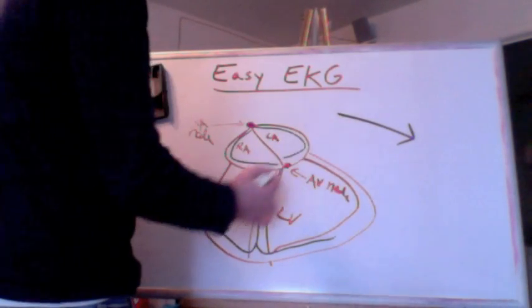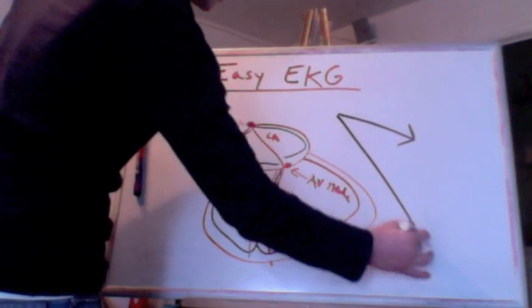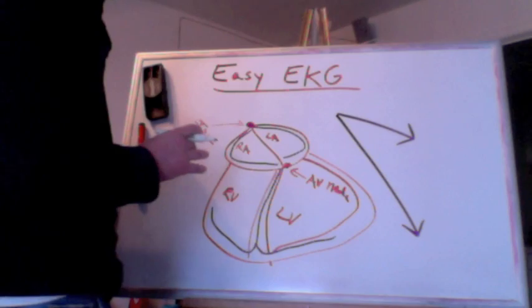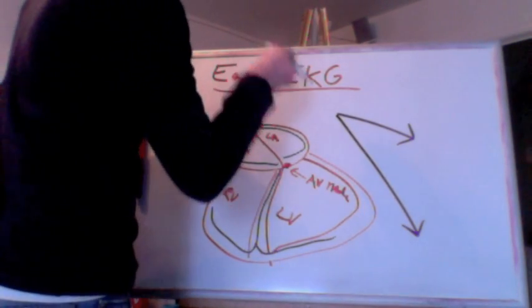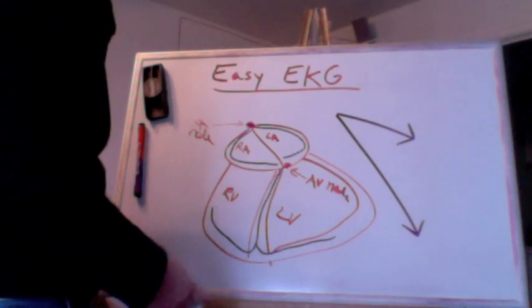When we're looking at the ventricles, their depolarization is bigger, right? Because we have more muscle tissue here, we're going to have a more positive response. So our vector is going to be pointing to around our left hip, or our left foot, you could think of.